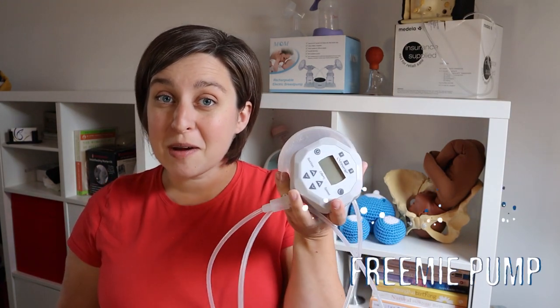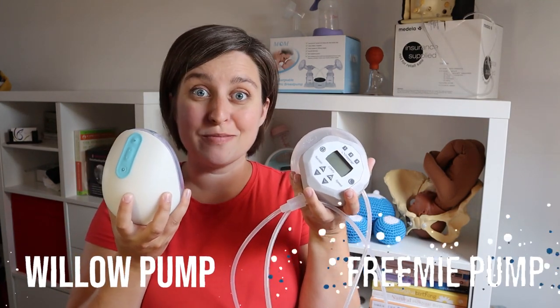Hey everyone, it's Allison here with New Little Life. I brought you up to my breastfeeding corner today because I want to compare two wearable pumps for you. These two pumps are quite different, so we're going to look at some of the pros and cons of each one to help you decide which one you want to get. Today we're going to be looking at the Free Me pump versus the Willow.